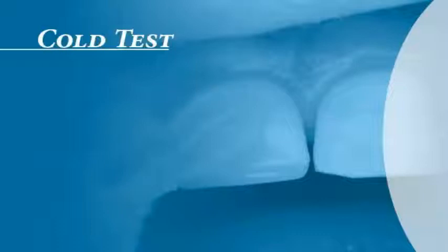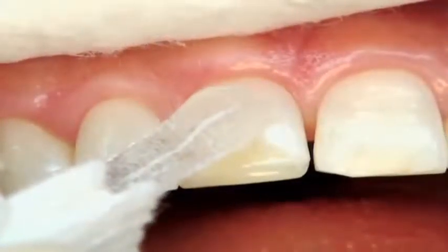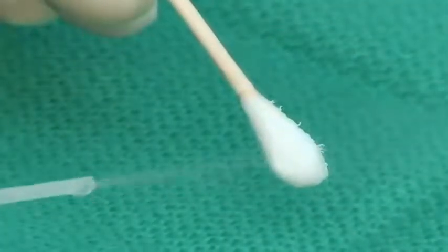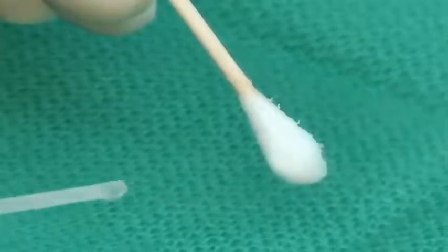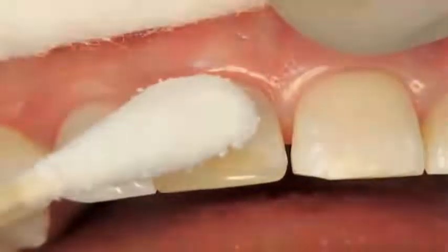Cold tests. After the tooth is isolated with cotton rolls and dried, an ice stick or a large cotton pellet saturated with refrigerant is applied. Cold is more effective on anterior than posterior teeth.